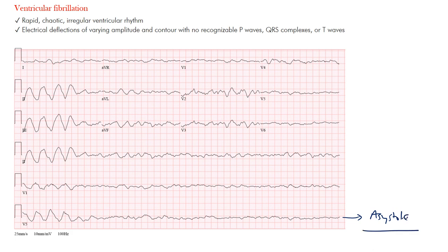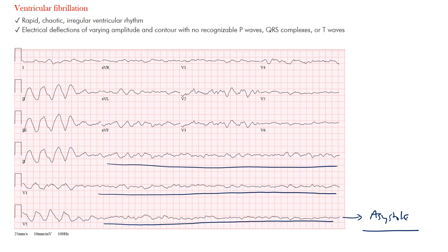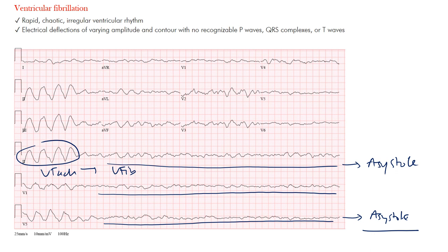What we see here are these chaotic, rapid, irregular waveforms. Notice this is actually VT — ventricular tachycardia — going into ventricular fibrillation. If it continues, eventually without any life support it can go into asystole, that flat line. Ventricular tachycardia has more of a regular shape to its complexes, then all these fibrillatory waves appear.